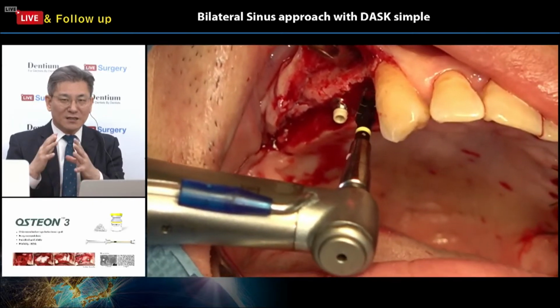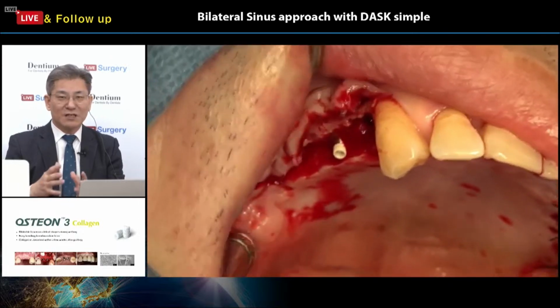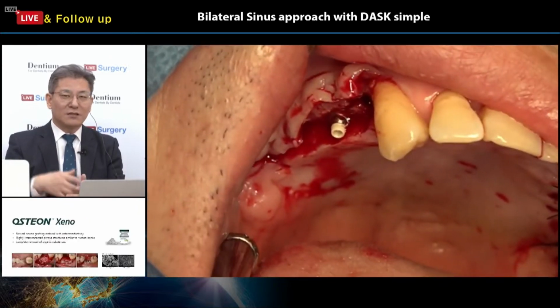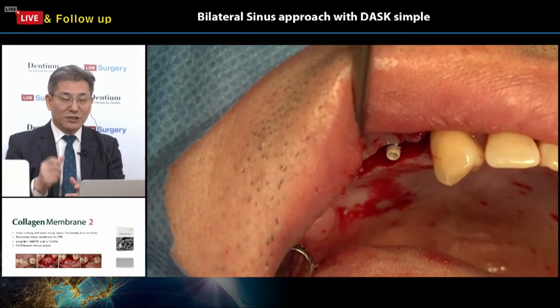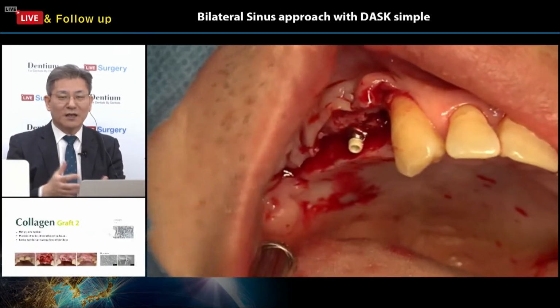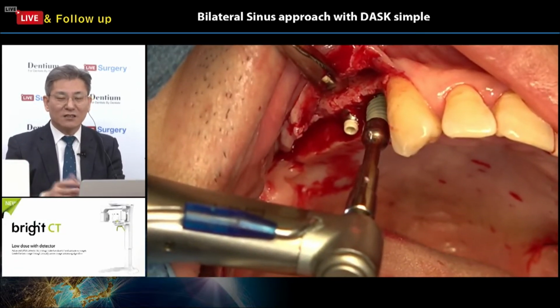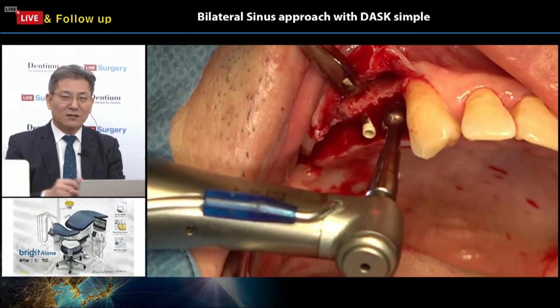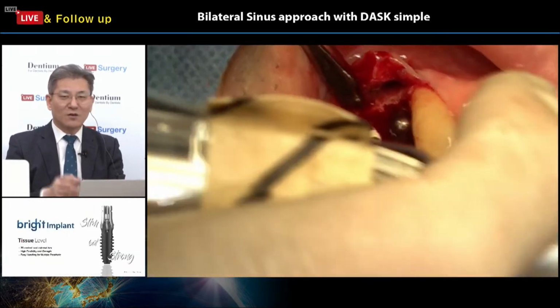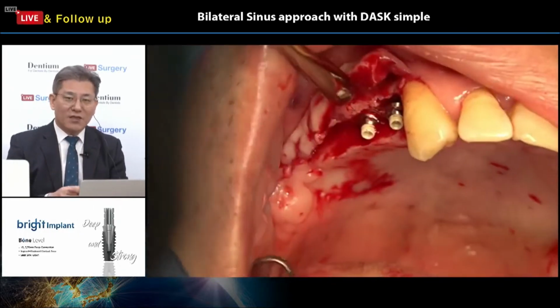Basically, this one is external connection type. The brands of tissue level, like Straumann and any other company, are actually internal connection, even though they are tissue level. However, this Bright is the external connection type. So it is a big different thing.